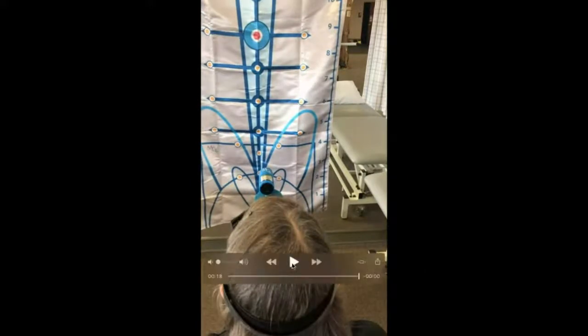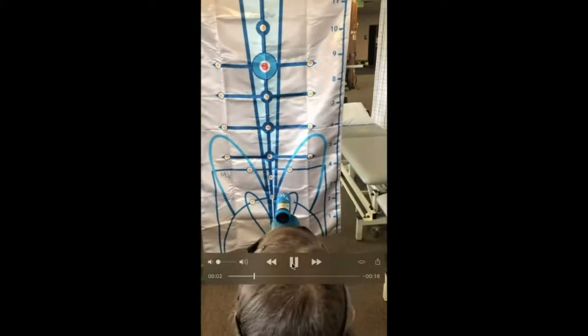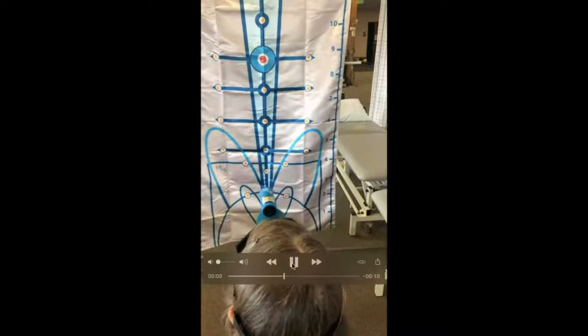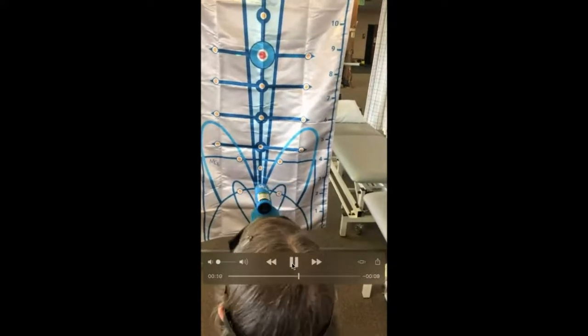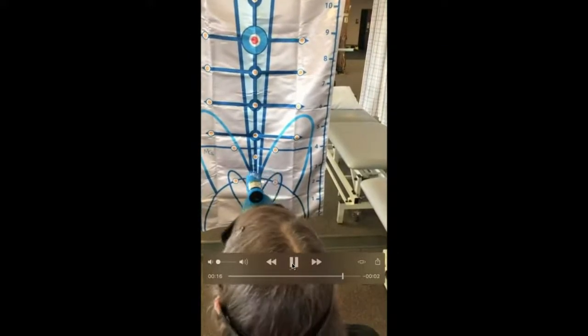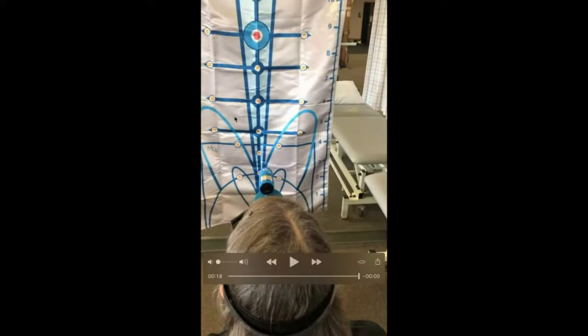Okay, let's watch that again. And more equal motion side to side. So she's less titubations, starting to get a nice smoother head motion here, side to side. Sometimes she overcorrects, but she's still learning. And all this is practice and feedback, understanding what her dysfunction was.